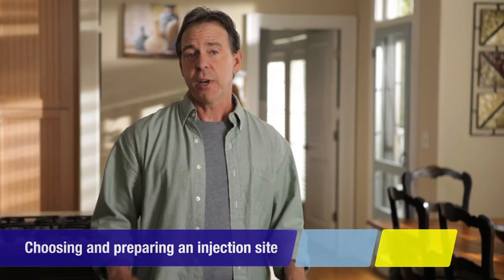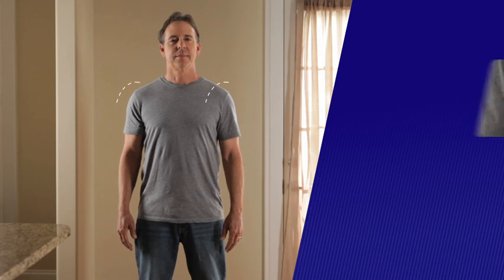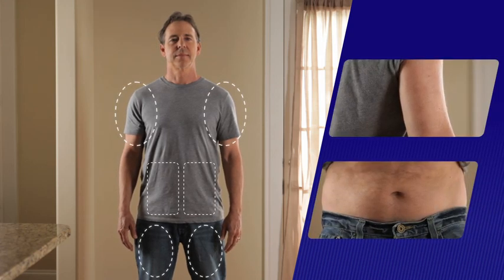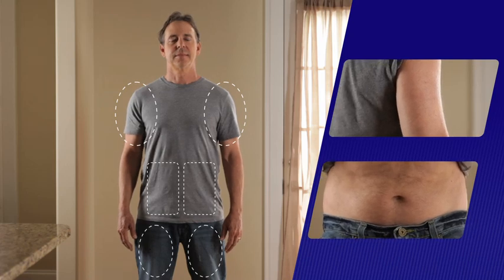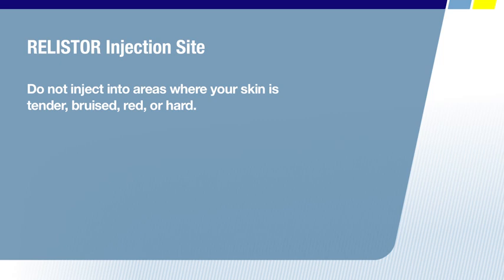Now let's look at how to choose and prepare the area where you'll inject. Relistor should be injected into the upper arms, upper thighs, or abdomen. And you should only use the upper arm area if someone else is doing your injection for you. It's important that you don't inject into the exact same spot each time. Don't inject into areas where your skin is tender, bruised, red, or hard. Also, avoid areas with scars or stretch marks.